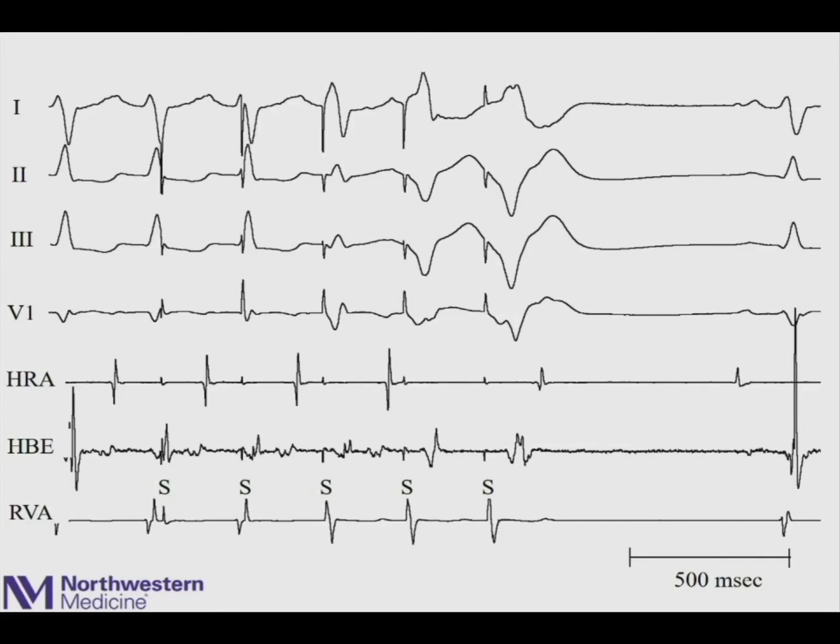If you have fusion, there must be antegrade conduction over the His bundle. How would you have gotten into the circuit if this is an AV nodal dependent rhythm? It can't be. So this is not just excluding atrial tach, it also excludes AV nodal reentry. So this right here is diagnostic of this tachycardia being AV reentry.